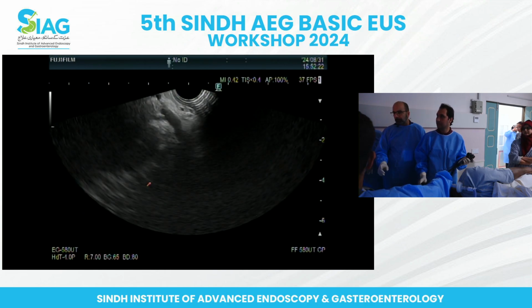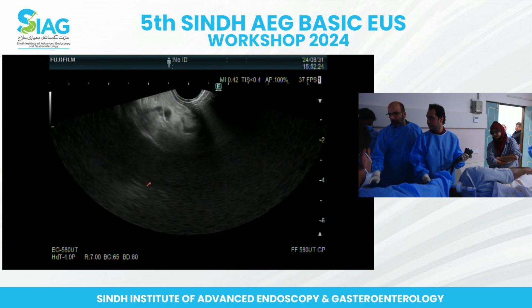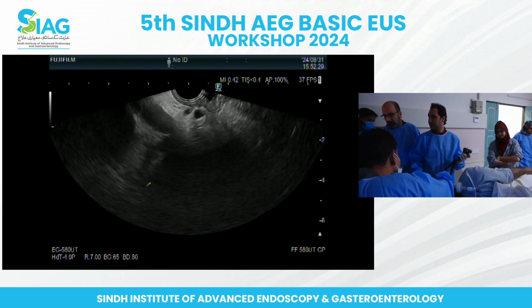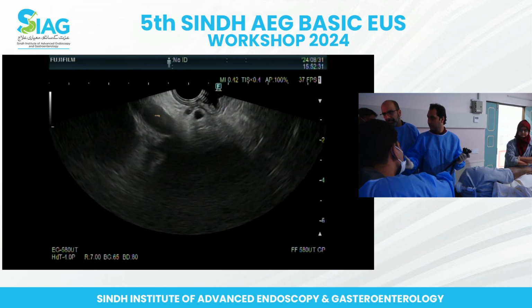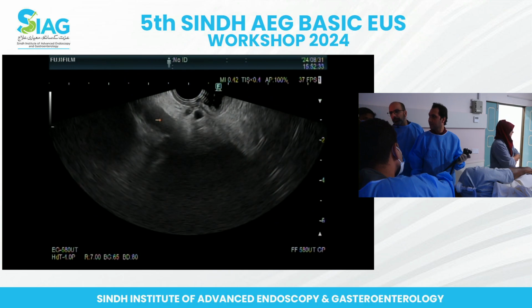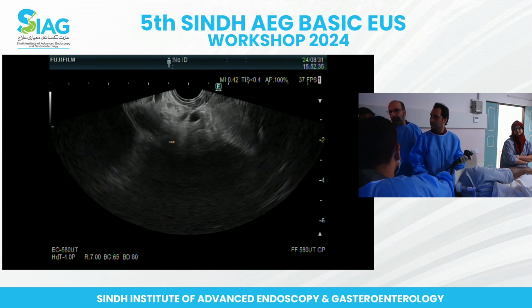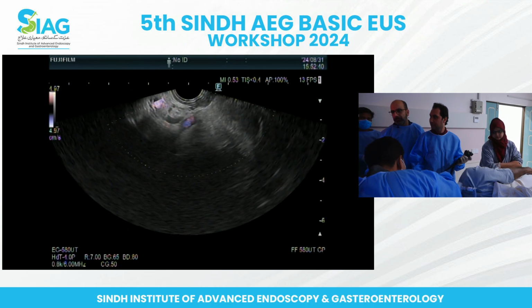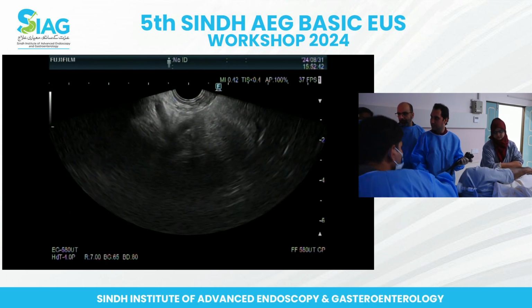Good. So now we're in the bulb and push forward a tiny bit. Good. So right away you saw this, that's the portal vein. Good. Yeah. So now that you have the portal vein, you know that the bile duct should be close by. I don't know if this is it or not, but no, it's an artery, so it's a vessel. So keep the portal vein in view.